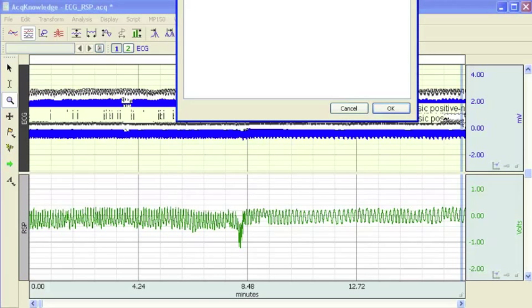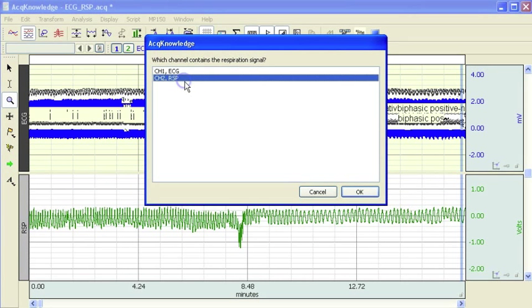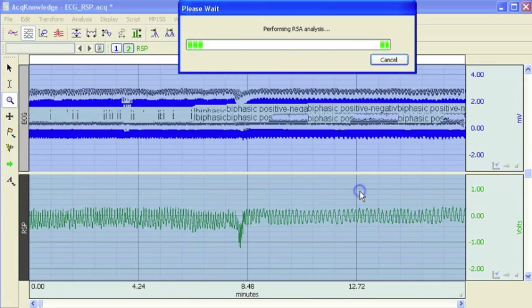Okay, so the software has now gone through and identified the ECG. Now we are asked to identify the respiration channel.